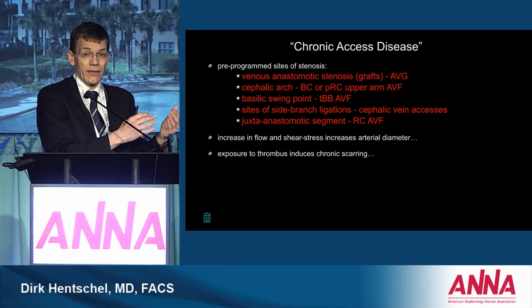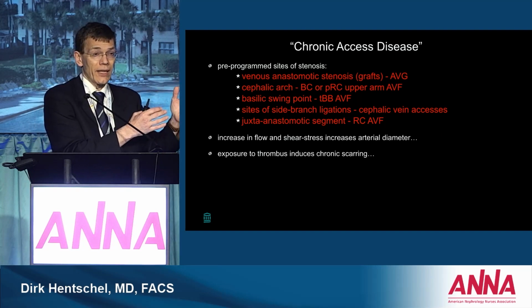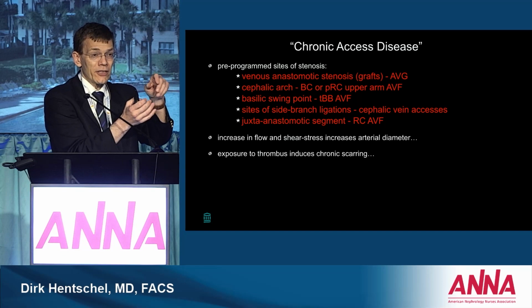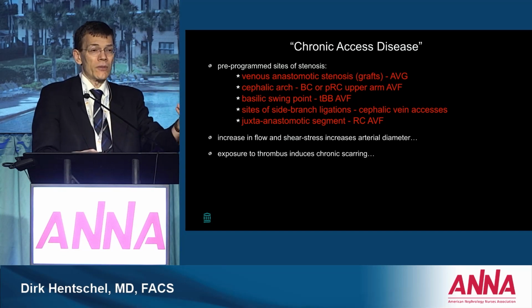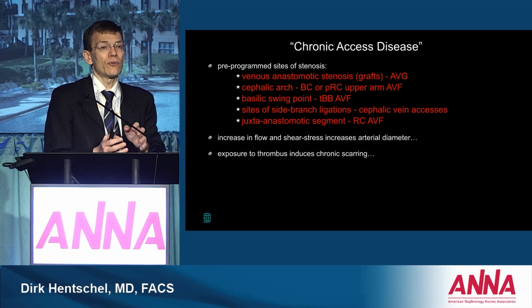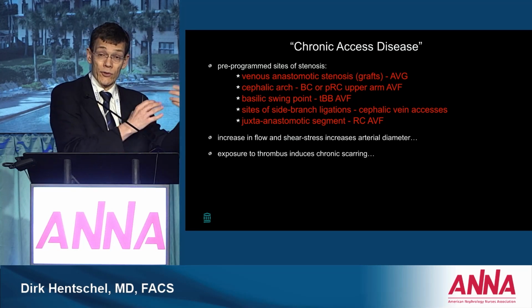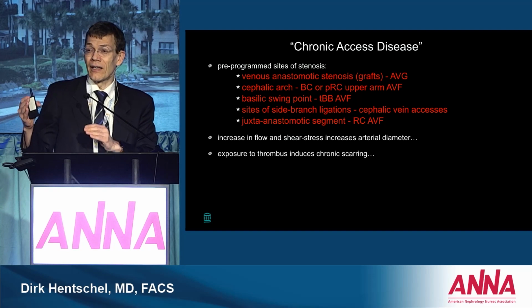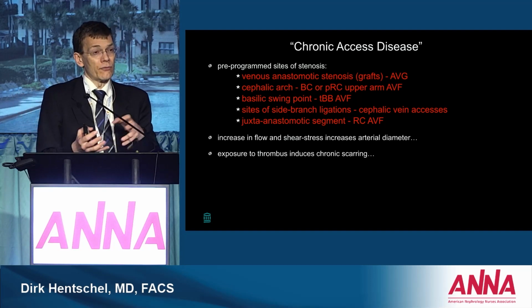That vein injury, as you saw in that first slide, where the vein narrowed down in the cephalic vein, that patient, once there's thrombus exposure, some vein segments will just continue to sclerose down, and you either have to surgically replace them or you have to place a stent graft to take that segment out of a responsive circuit.